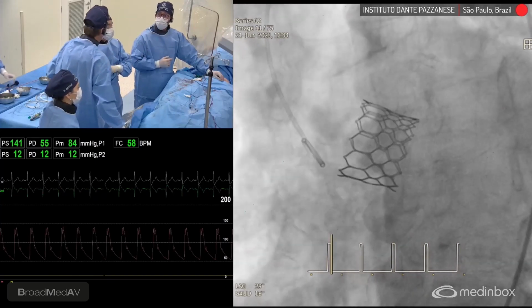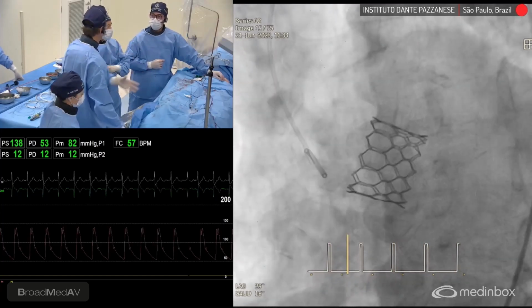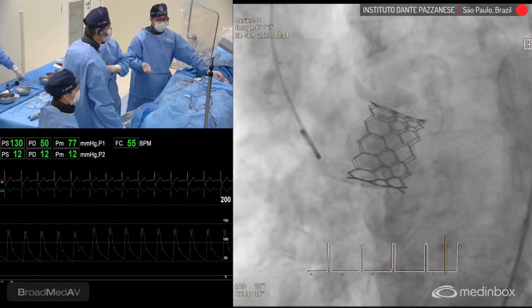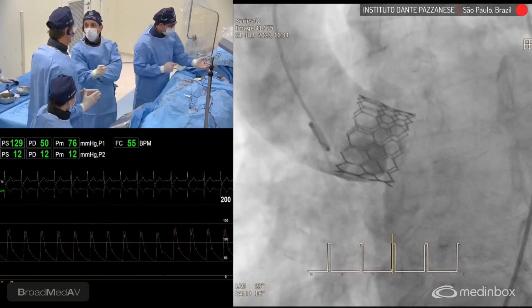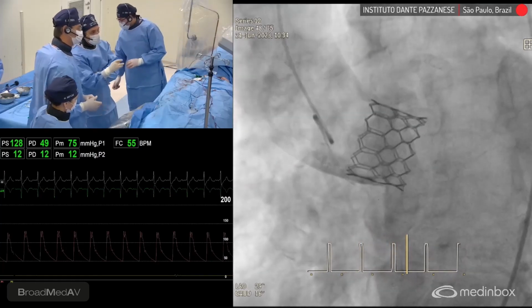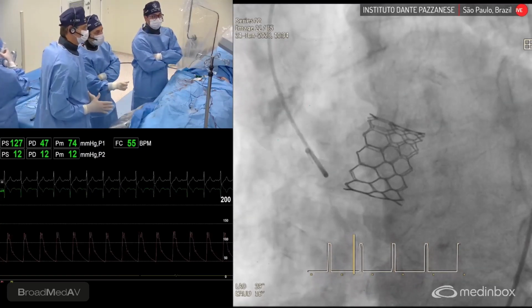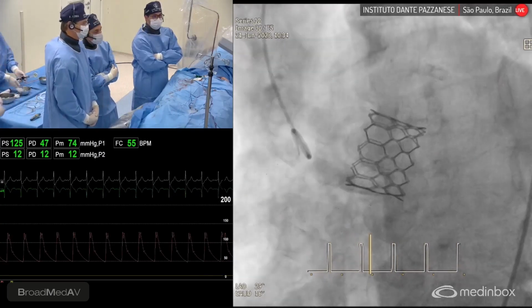But have you done that in a patient that you placed a TAVI in, and some years or months later you need to do a coronary intervention in this valve? In this valve specifically, no. But after the implantation, we sometimes did catheterization of the left main. It's going to be easy. It's easier with a balloon expandable valve with a small profile, and the next generation of balloon expandable valves will also make it possible to perform commissural alignment, just to make it easier to cannulate the coronaries in the future.